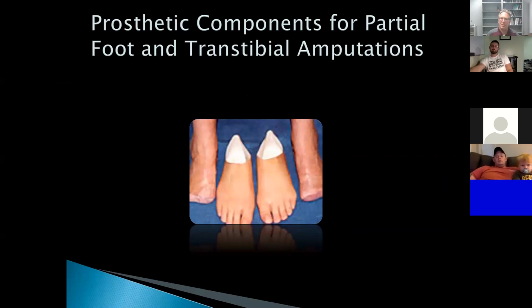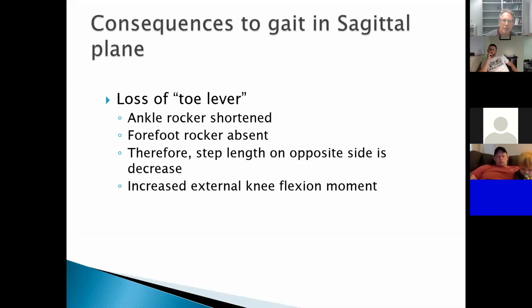All right. So we're going to talk about the devices that make up prostheses. And what you see here in the picture are the feet of somebody who's had a rather long transmetatarsal amputation and very nice natural-looking prostheses. Okay, in fact, we're going to start with thinking about that level of amputation, especially the transmetatarsal amputation, which is fairly common.